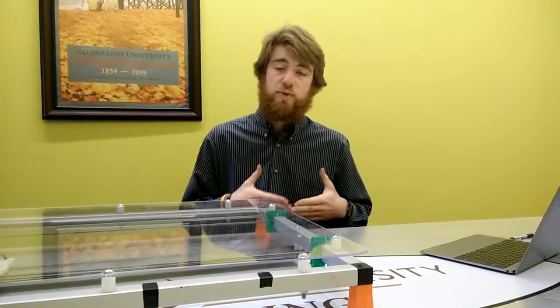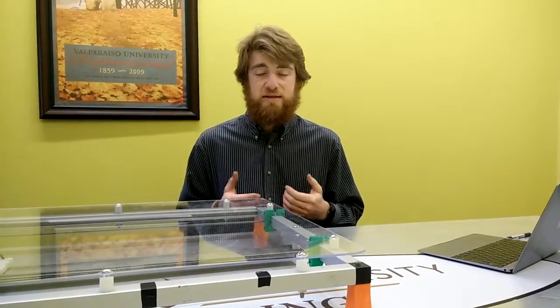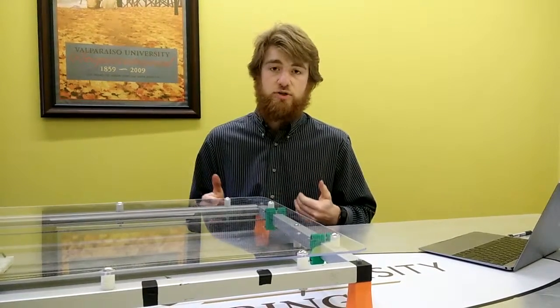We decided to go with the third approach because we found it to be the most robust in order to suit a variety of different infants and sizes, and also a variety of different cribs. Therefore, we designed a scanner to measure light energy.